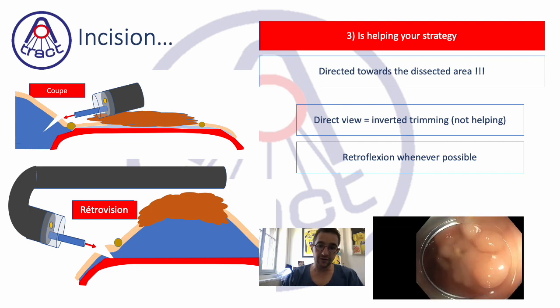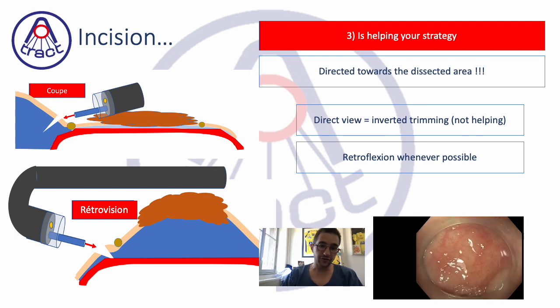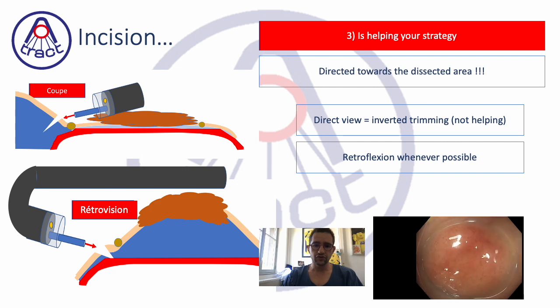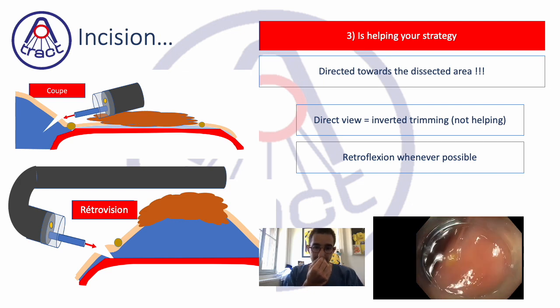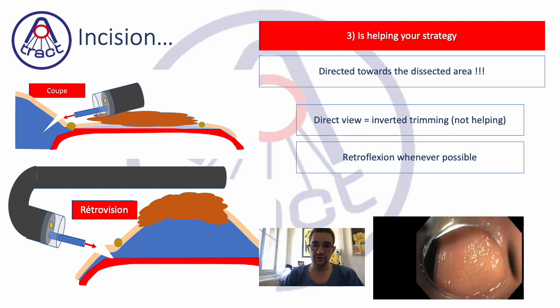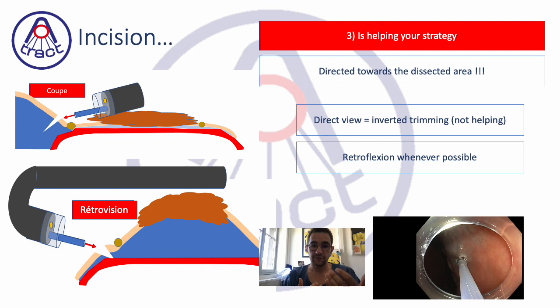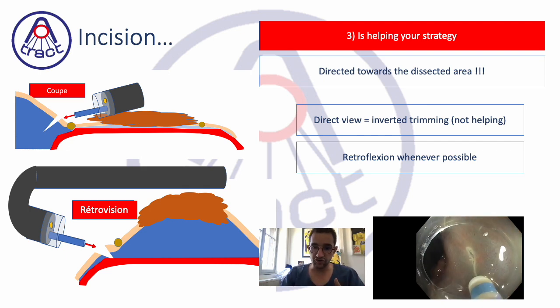...that is difficult to access in direct position — it is very difficult to find the injection doing it in direct viewing. But when we do the retroflexion, the lesion is close to the right angle. We pass into retroflexion and then your direction is towards the lesion. By doing this, you will have an injection but also an incision which is more effective because it goes to the lesion and it begins the ESD process. It is not always feasible, but thanks to traction it's feasible to do an incision at the oral side using a straight forward position. However, if you can do your retroflexion, you will have a more effective incision and trimming.